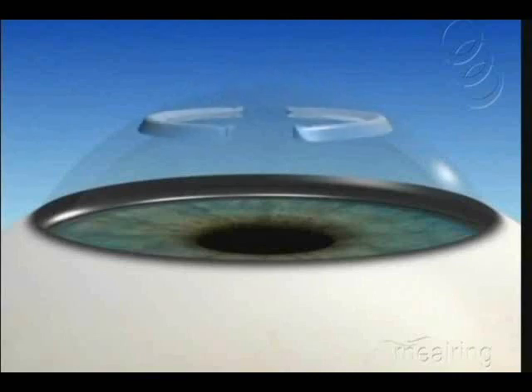At the slit lamp, verify the correct ring depth and position. The result is a more regular and flatter cornea with clearer vision.